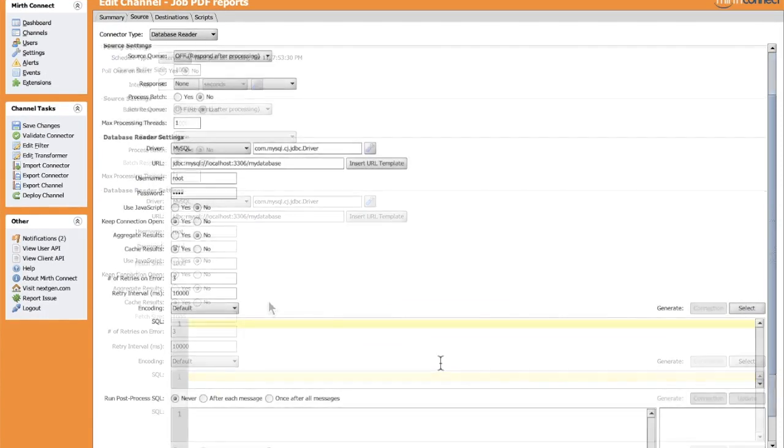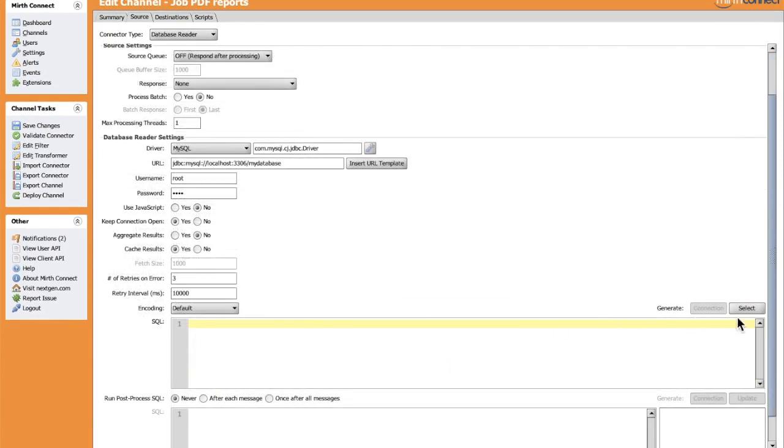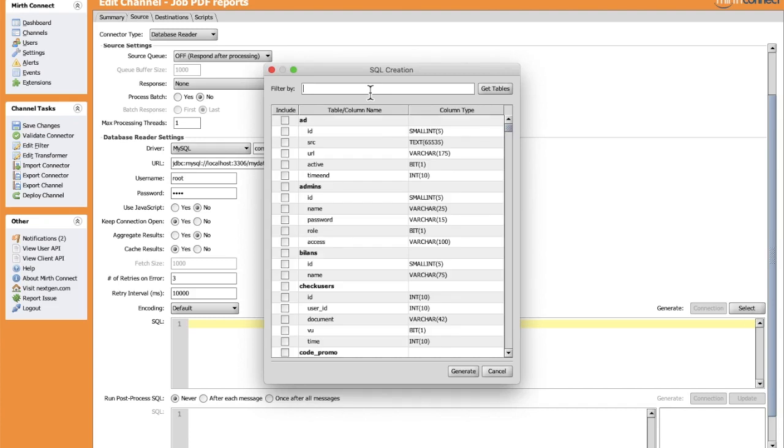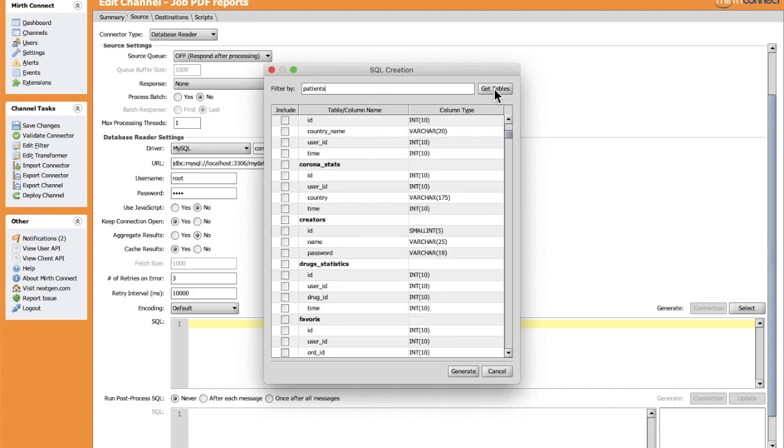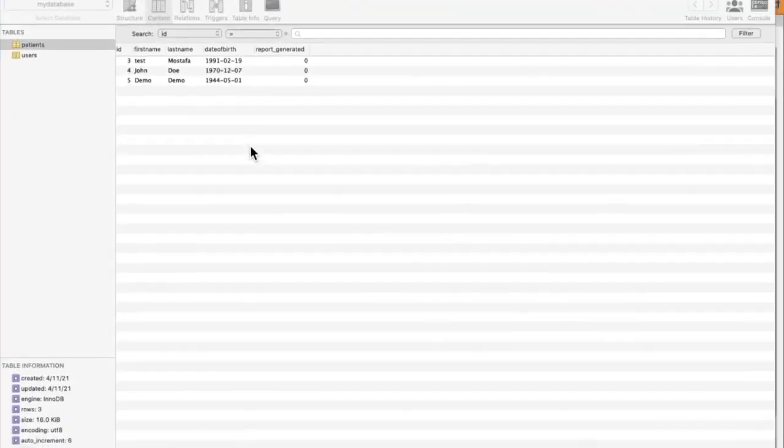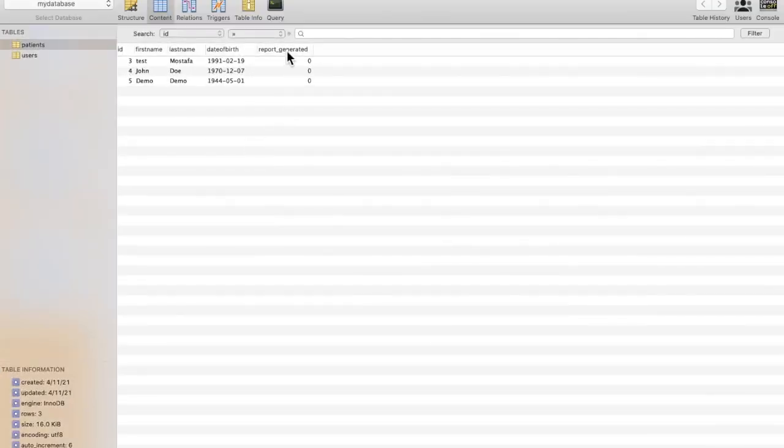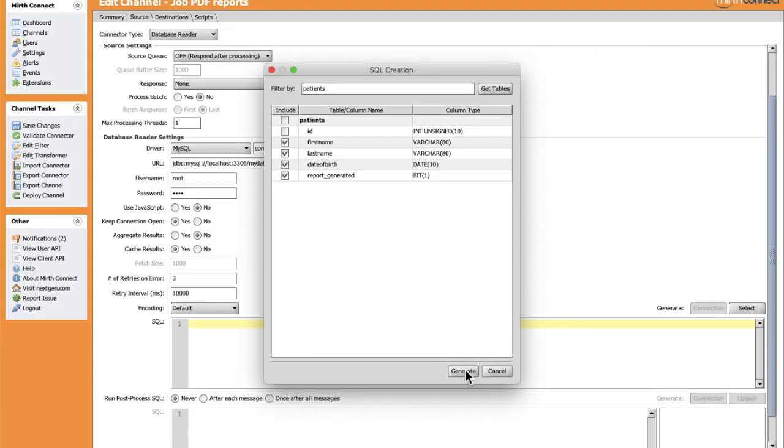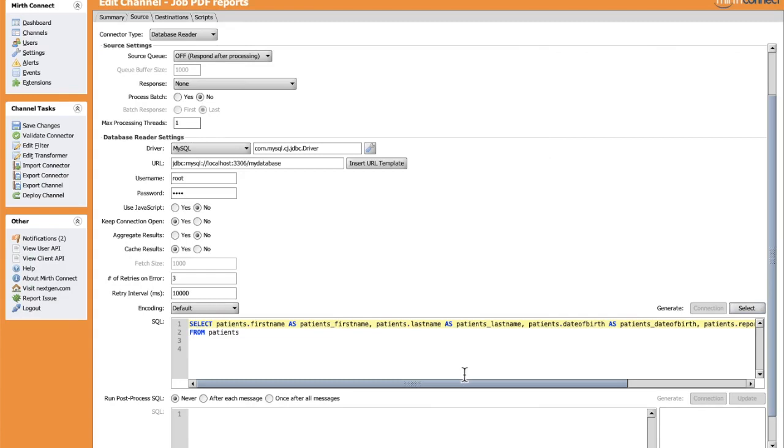In the SQL query, we will select from the table patients the fields that interest us. Let's look for the table patients. Okay, let's pick the first name, last name, date of birth. I added this column to control the data that I want to include for each job iteration. Okay, we generated the query here.